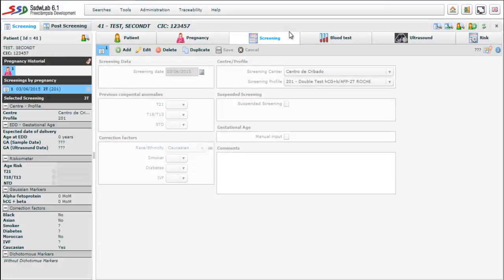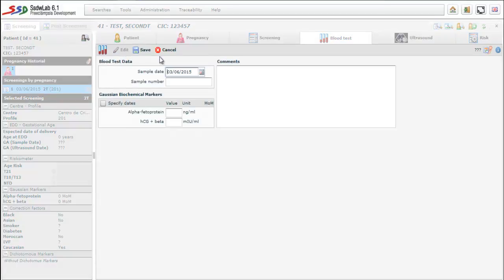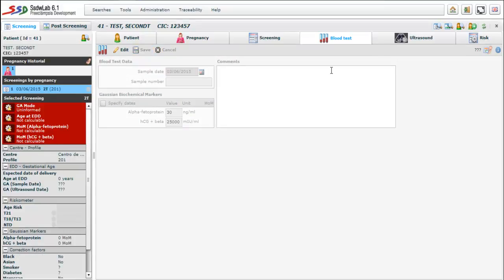The next is blood test folder. We enter the date of the sample which normally coincides with the date of screening. We will also enter the values of Gaussian biochemical markers that in the double test are alpha-fetoprotein and human chorionic gonadotropin plus beta.